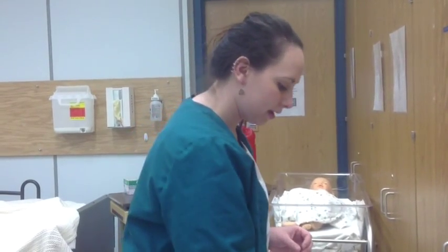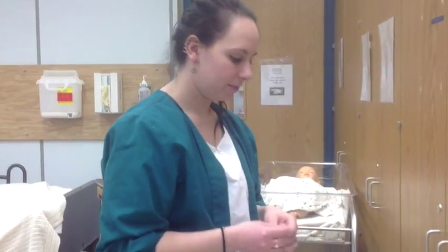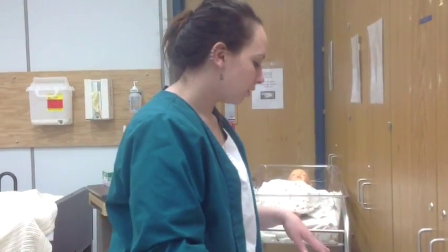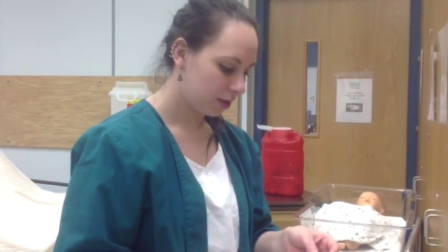So now I'm going to show you how to draw it up. So first things first, you want to find the right syringe. So we need 0.5 mLs. So a 3 ml syringe is going to be really large. So the best one I have on hand right now is a 1 ml syringe. This one is already set up for me, so I know it's the one I need to use.